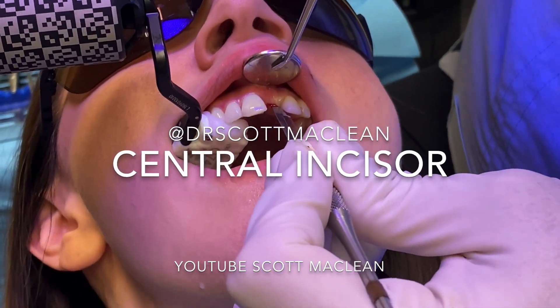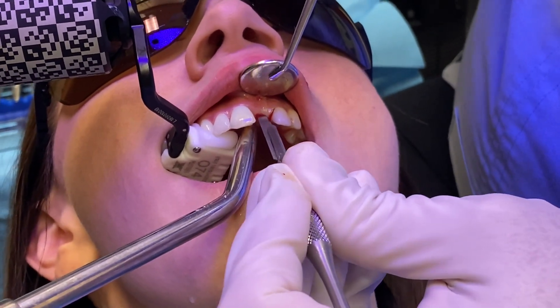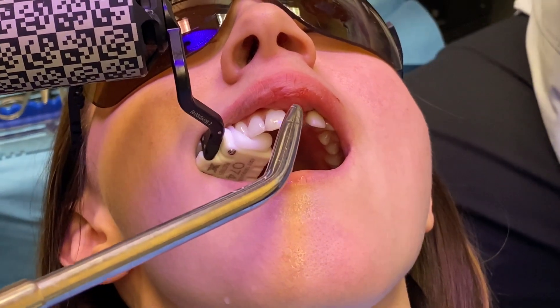When we flap, I usually like to flap right around that osteotomy so you can actually see where the osteotomy is going to start, because the X-Guide takes you to that point.